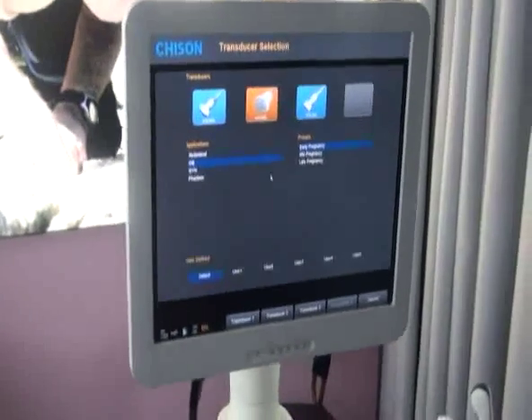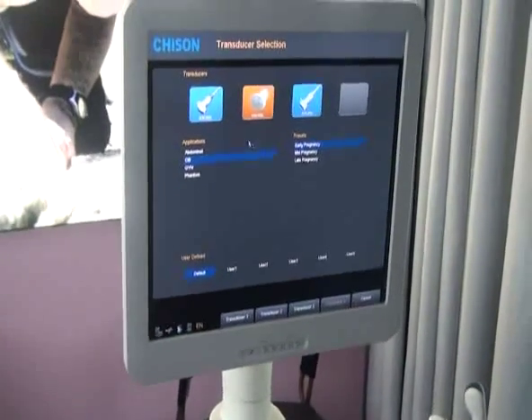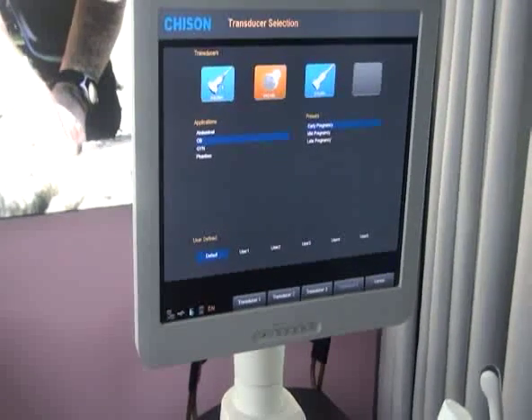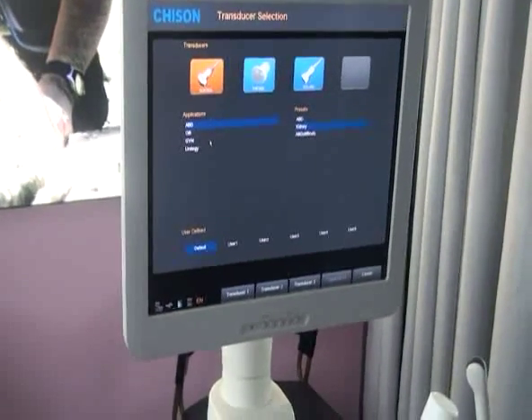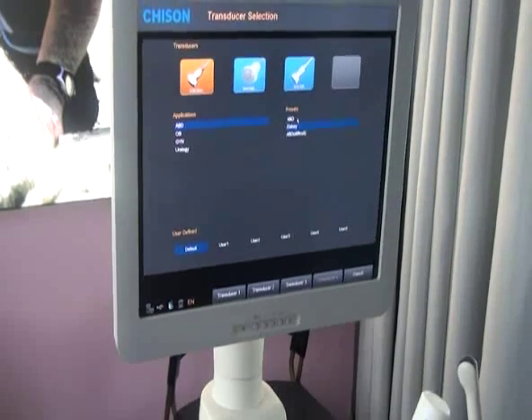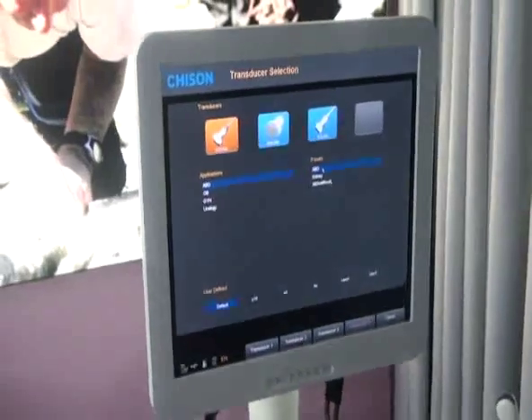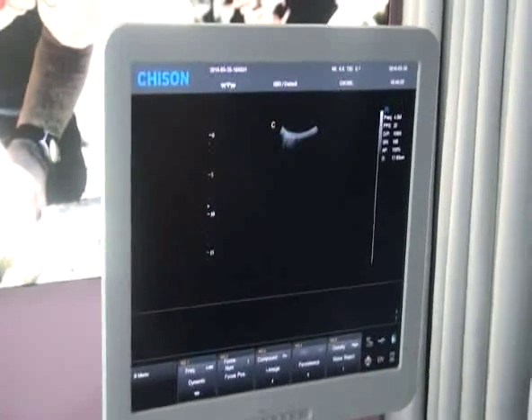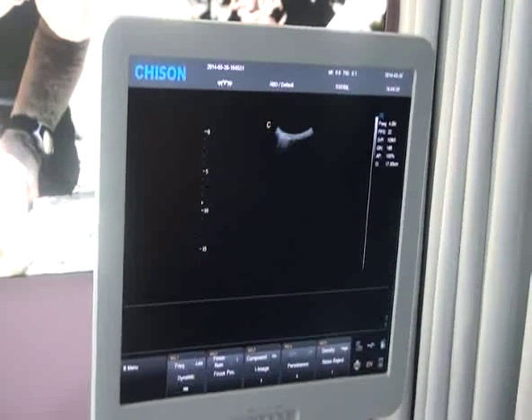Second, press the probe key to enter the transducer selection interface. Move the trackball and press the Enter key to choose the probe, application, and preset. Double-click the Enter key to enter into the default preset in B mode.